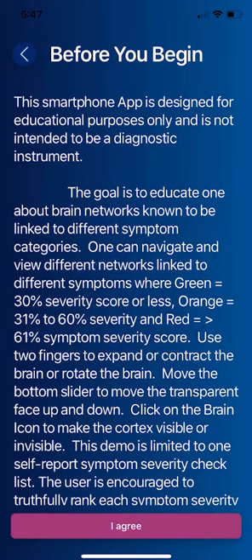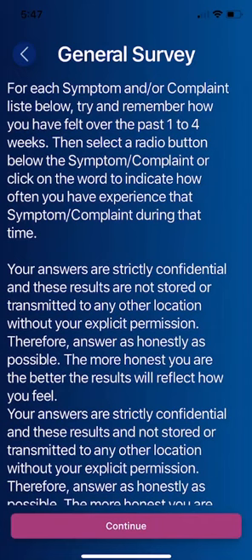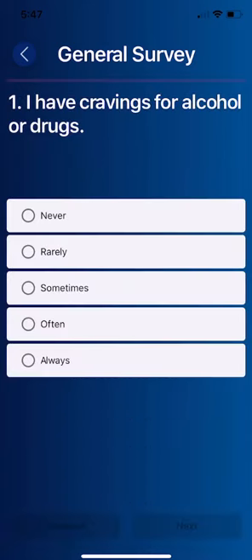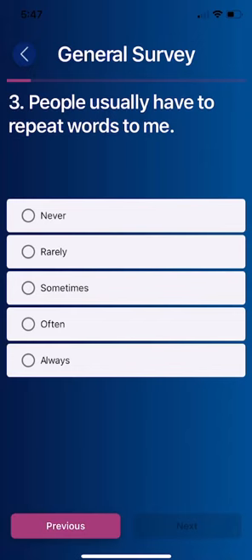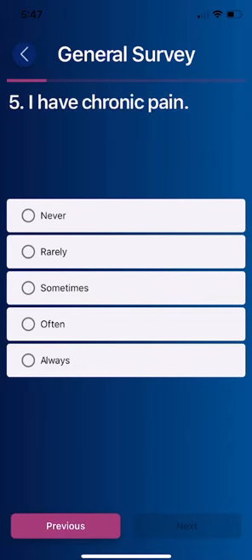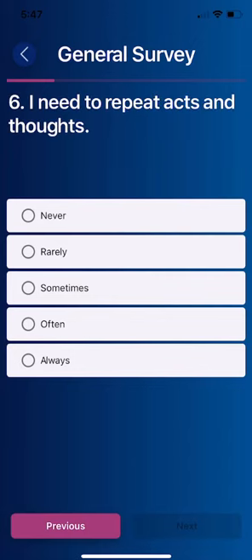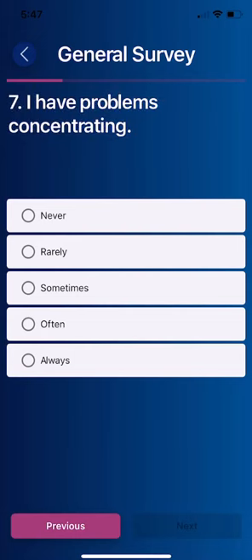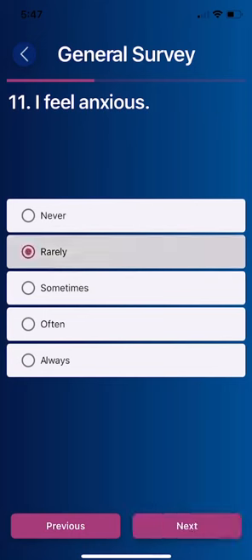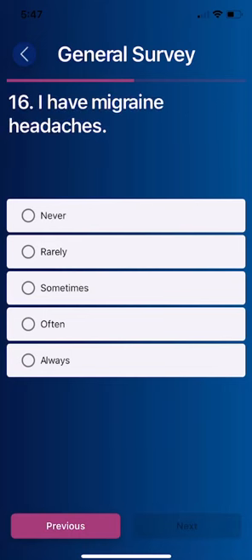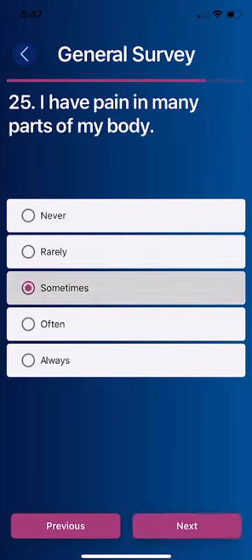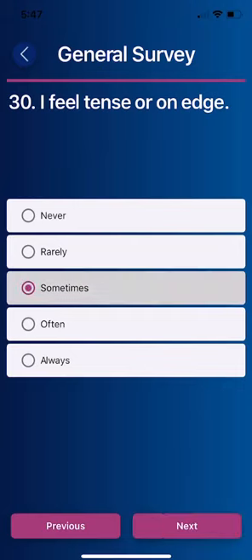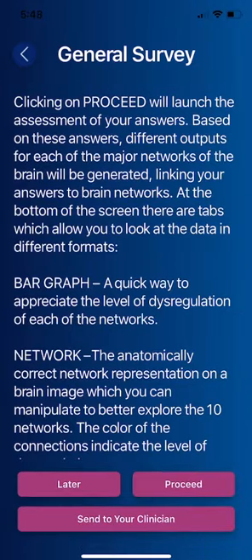I'm clicking the general survey. You have a screen that describes what it is and introduces you to it. The first question is 'I have cravings for alcohol or drugs.' Then: 'I am easily distracted,' 'People usually have to repeat words to me,' 'I have blurred vision,' 'I have chronic pain,' 'I need to repeat acts and thoughts,' and 'I have problems concentrating.' I'm just going to randomly click through these, but patients and individuals should honestly answer the questions before them.